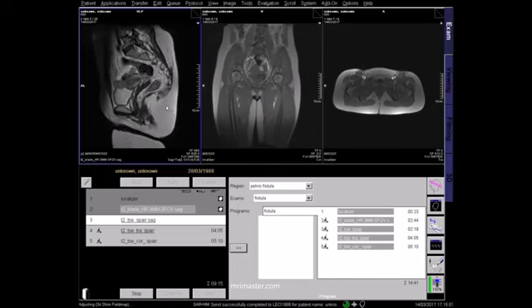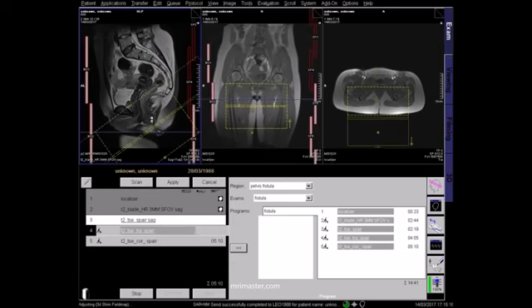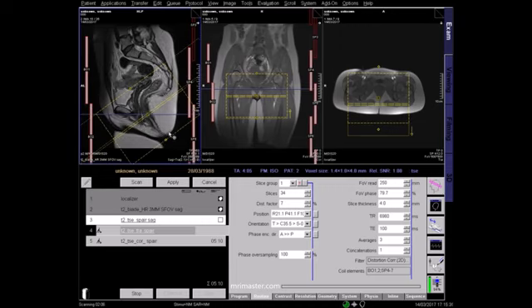Once your first sagittal sequence is complete, you can plan a high-resolution T2 axial fat-sat. Slices should run perpendicular to the anal canal. Once again, it's very important to cover from the mid-rectum right down to the skin surface of the buttock, as fistulae can track through the tissues to open through the skin.